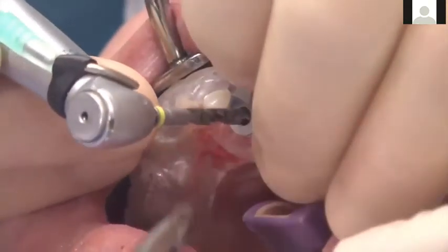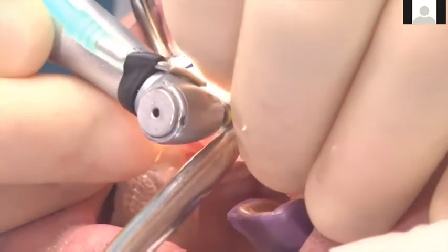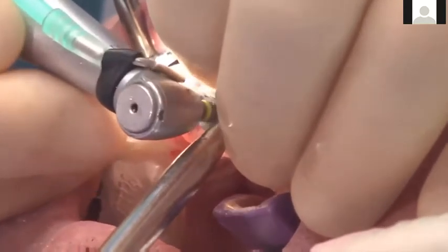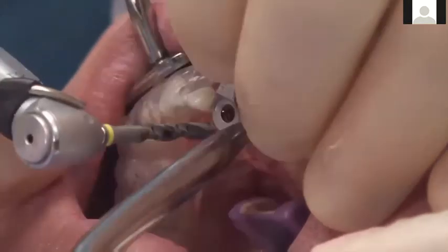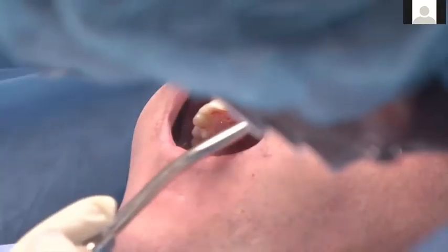Here's the second drill. In this case, it's the final drill, because with the Straumann 3.3, you drill only up to the 2.8 millimeter drill. So this is the final drill, again, going up and down in a pumping motion. Now, once we have done this and taken this out and rinsed the site out, we could theoretically go ahead and place the implant.